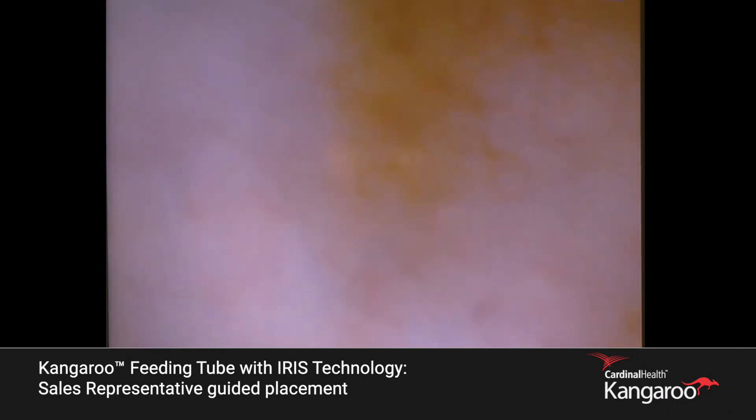Keep that pressure behind it. There it goes — see that rapid movement? Now you're seeing these finger-like projections, and you can see a kind of yellow-orange color to the tissue. We're confident we're in the right place. The tube is in our desired location, so we'll go ahead and complete the procedure.